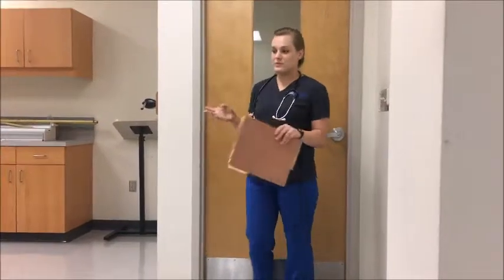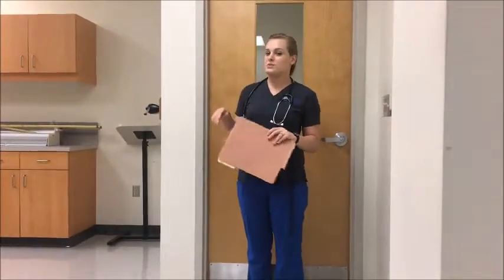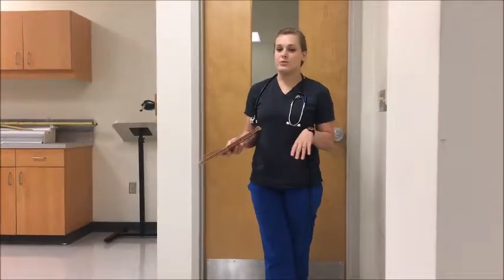Hi, I'm Ksenia. I'm going to be doing my video for the simple mask today. So for this procedure, before walking into the patient's room, you would check the patient's chart and see that there's a doctor's order for a simple mask.